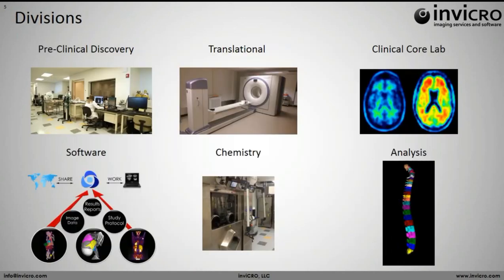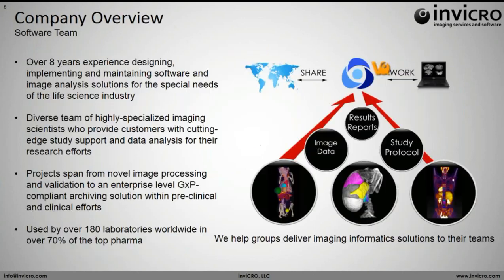So as I mentioned, we have a variety of divisions: preclinical, translational, clinical, all of which are really supported by our software, chemistry, and analysis groups. And of course today we're primarily interested in talking about the software.